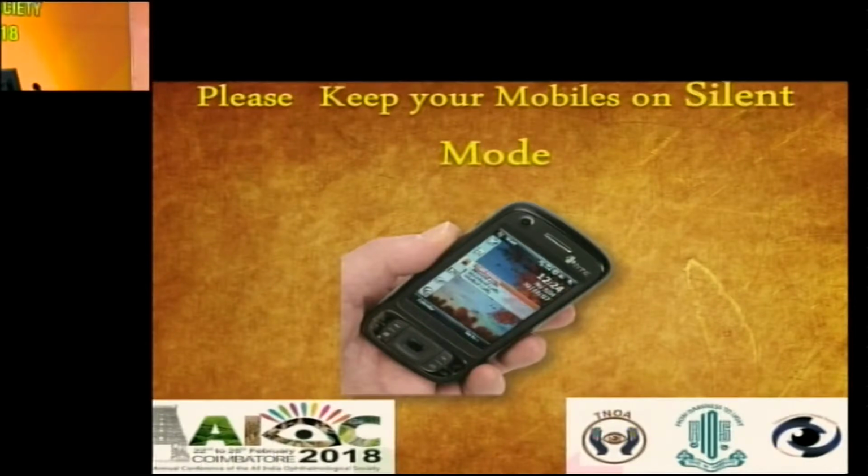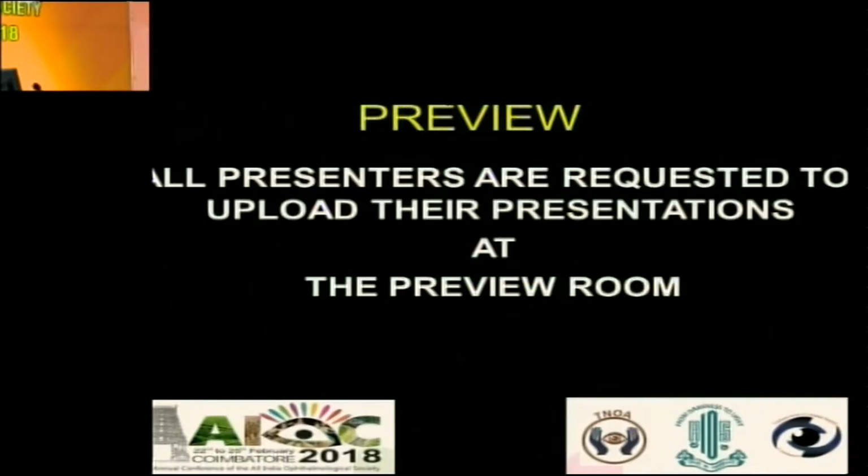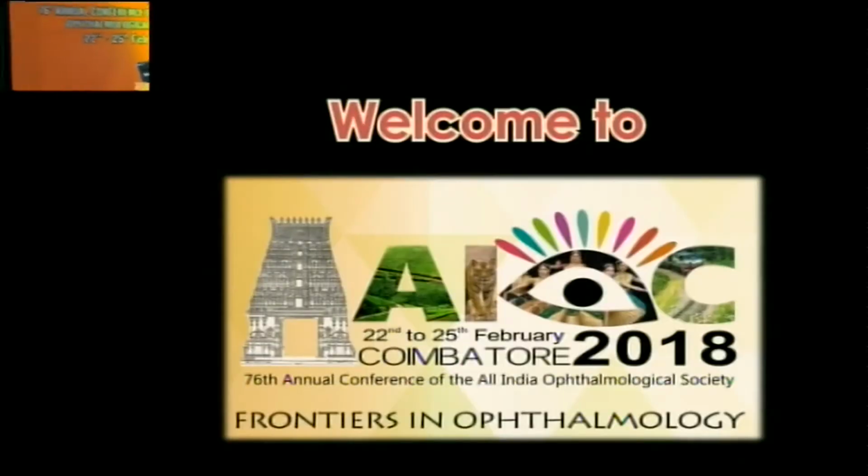Thank you, Dr. Vinod, for the beautiful presentation on soft cataract, and very nicely explained the problems we come across in soft cataract. These soft cataracts actually have a different character in themselves because, as he very rightly said, it's very difficult to hold them, very difficult to crack them, and very difficult to rotate.